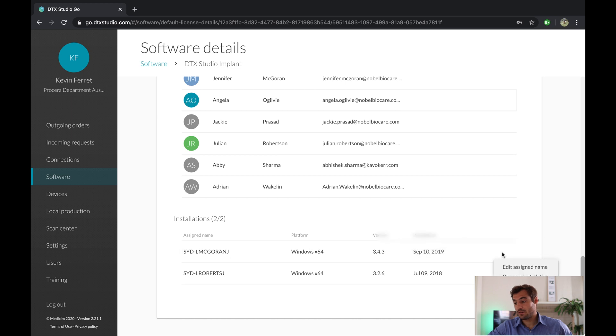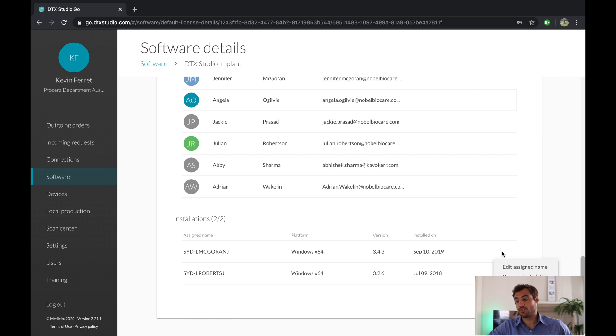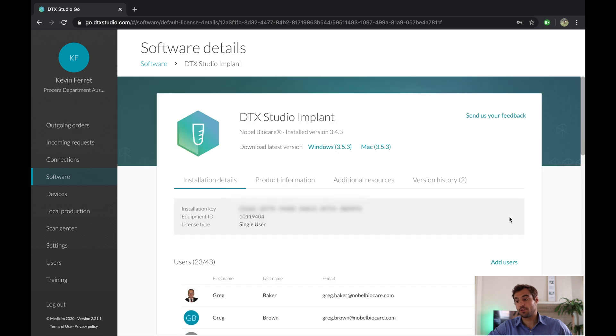Click on the three dots here, and once that's done, just remove the installation from the computer. This will remove the installation from another computer. It's going to unlink that computer from the software.